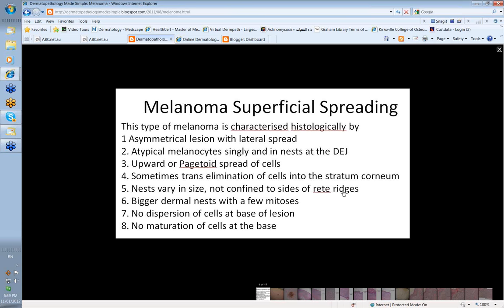But you get other dysplastic nevi in an individual, not an older person, but an individual who's got multiple atypical looking nevi, big ones clinically, variation in color, irregular edges to them. And these are the ones that the pathologist really has some difficulty with at times. We'll look back at the dysplastic nevus, but remember the main features of that was there's varying degree of atypia, there's bridging between the nests, a bit of epidermal spread lateral to the dermal borders of the lesion. Not a lot. These are called shoulders. And that lamellar fibrosis around the nest was important as well.